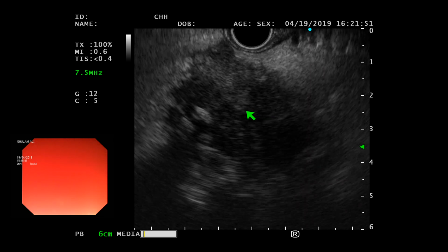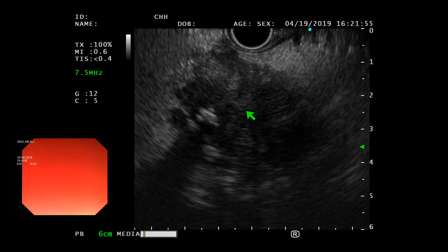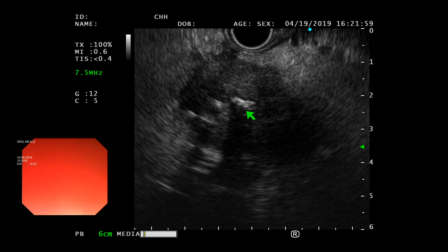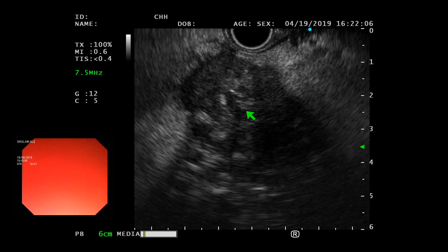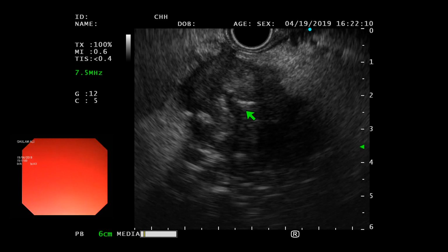Okay. So the area around the necrosis that is not the mass, they will see that necrotic area and bypass it. The margins of this area are very irregular. But is the adjacent area clear? What do you mean, adjacent area is clear? Adjacent area means everything outside the outline of the mass that we can see.